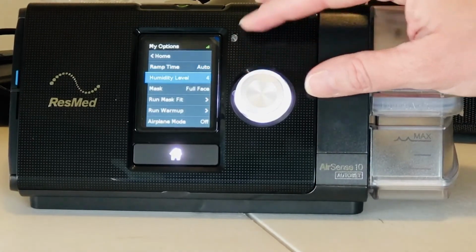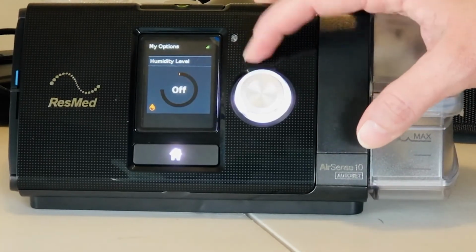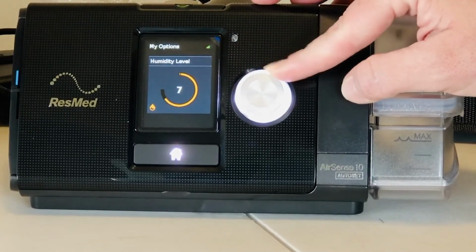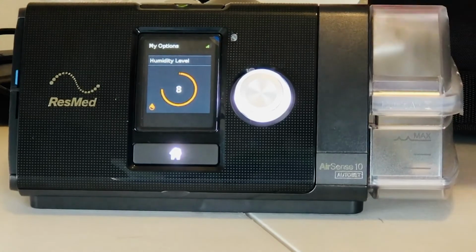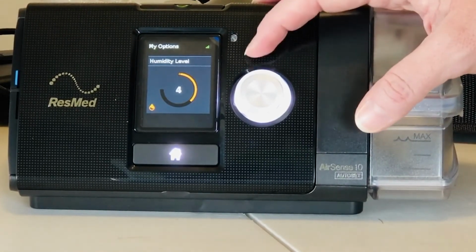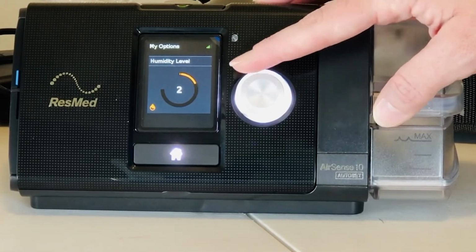You may also change humidity level. If you do not like heat, you may turn the heat plate off, or you can dial in a heat setting 1 through 8. 8 is humid, and you will use all of your water, and you may notice condensation in your tubing. I suggest starting in the 2 to 4 range and adjusting that based on your own comfort.